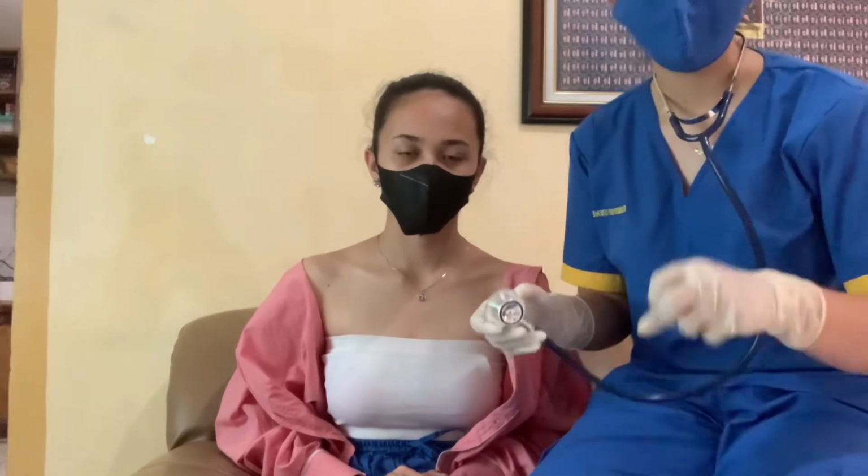After using the diaphragm of the stethoscope, we will now use the bell part, assessing the same locations, which are the aortic, pulmonic, Erb's point, tricuspid, and the apical. So this is the bell.